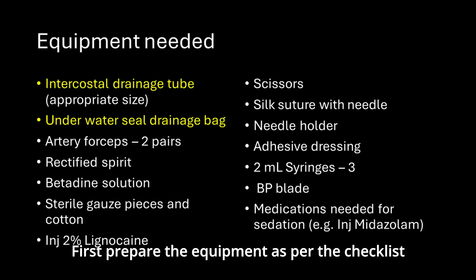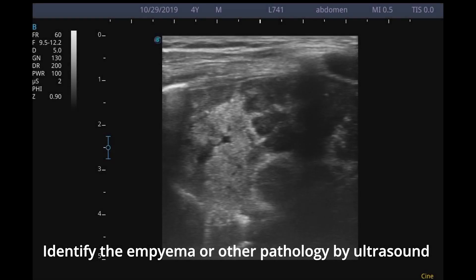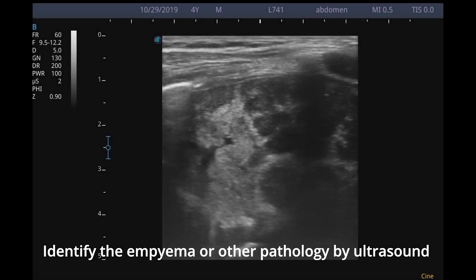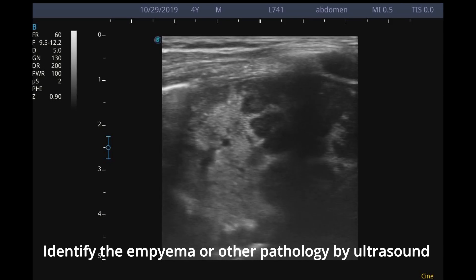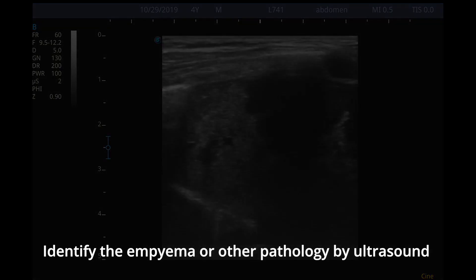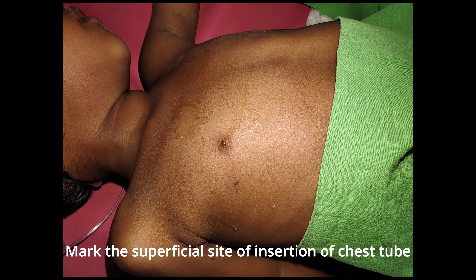First, prepare the equipment as per the checklist. Then identify the empyema or other pathology by ultrasound and determine the depth of insertion, which in this case was around 2.5 to 3 cm. Mark the superficial site of insertion of the chest tube.